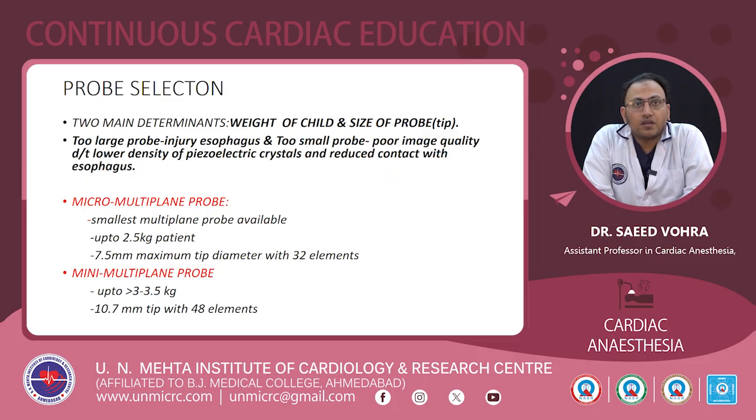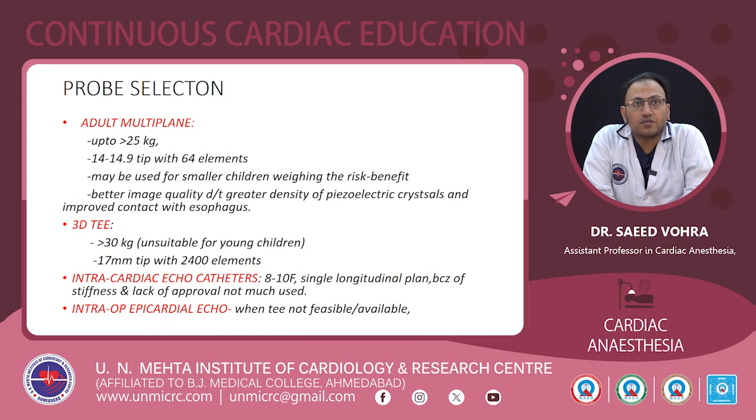So the smallest probe available is the micro multiplane probe. It can be used up to a child of 2.5 kg. The maximum tip diameter is 7.5 mm with 32 elements. The mini multiplane probe can be used in a child as small as 3 to 3.5 kg, with a tip diameter of 10.7 mm with 48 elements.